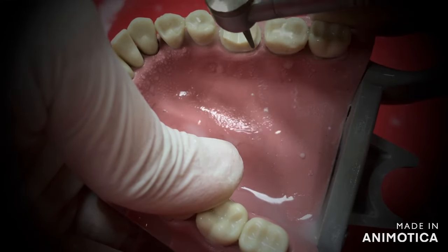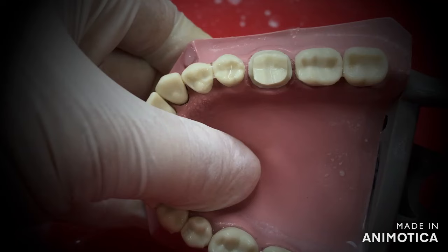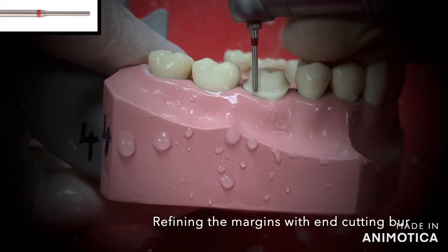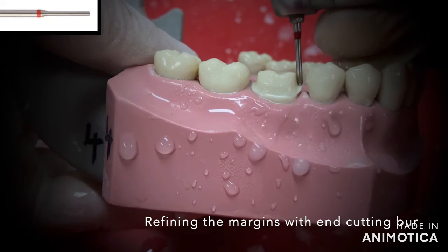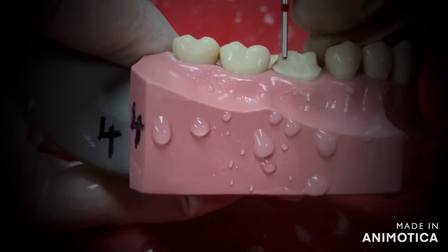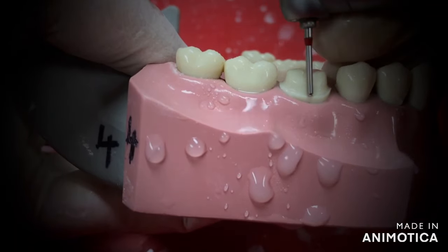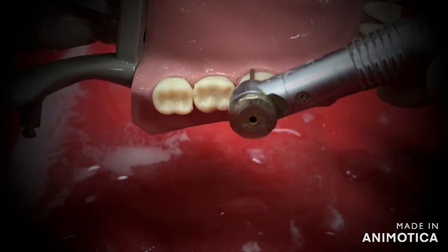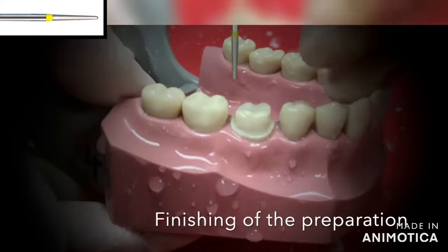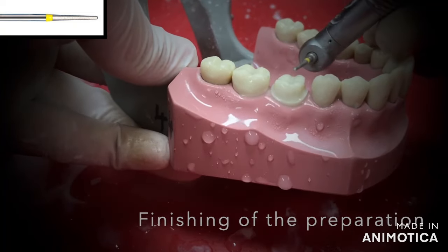Now we are almost done with the major part of the preparation. If you want to refine your margin, you can use an end-cutting burr — I have used EX18. Smoothen out the irregularities in your margin with this burr. This is an end-cutting burr where the diamond particles are only at the tip, so the rest of your preparation is quite safe. The last thing to do is smoothen out the entire preparation with a yellow band ball. Make sure that there are no sharp points or irregular surfaces on the prepared tooth. And with this we come to an end — this is how our tooth looks after we are done with our preparation.